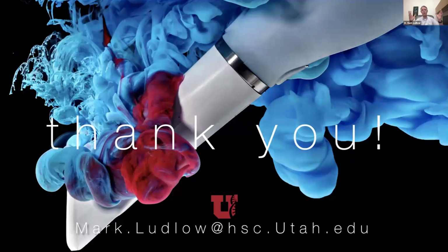And the OmniCam's the type of thing where, back in the day for full arch, oh my gosh, I groaned whenever I'd have to do a full arch on the OmniCam because it just wasn't great for it. That's why I was so excited when the Prime Scan came out. But what they did is they updated the software on the OmniCam. The OmniCam's actually a pretty darn good scanner with the newer updated software.